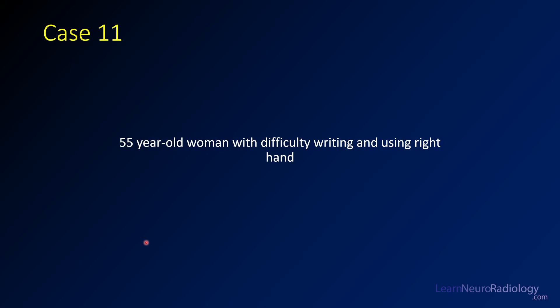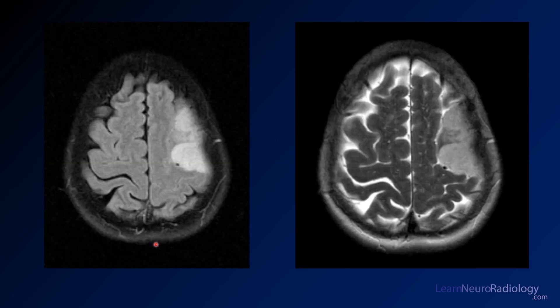Welcome to Learn Neuroradiology, and welcome to case 11 of this brain tumor ABR board review. Case number 11 is a 55-year-old woman who is having difficulty writing and using the right hand. Here on an MRI we have FLAIR and T2 axial images through the brain near the vertex. Take a look at that abnormality and figure out where you think it might be arising from.